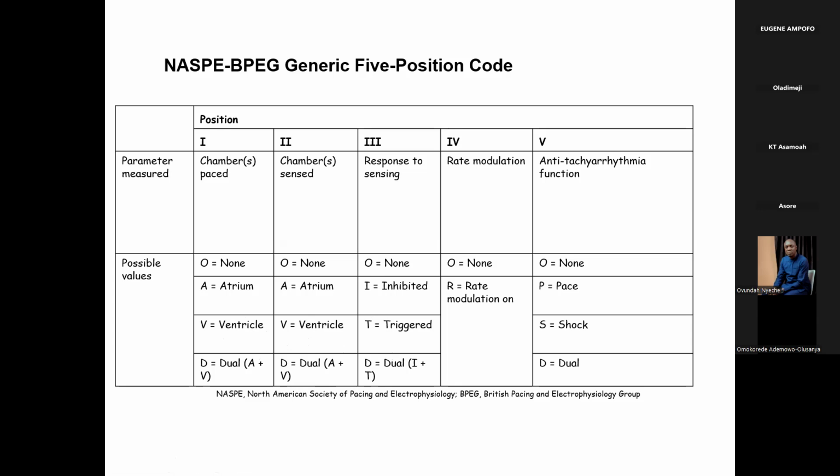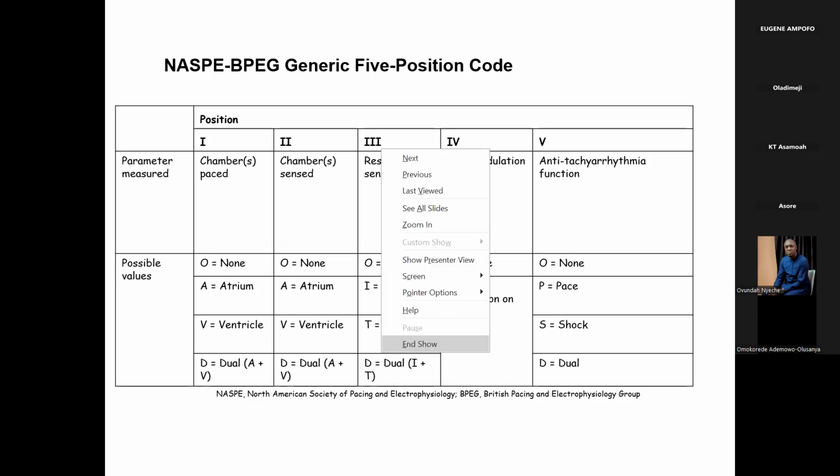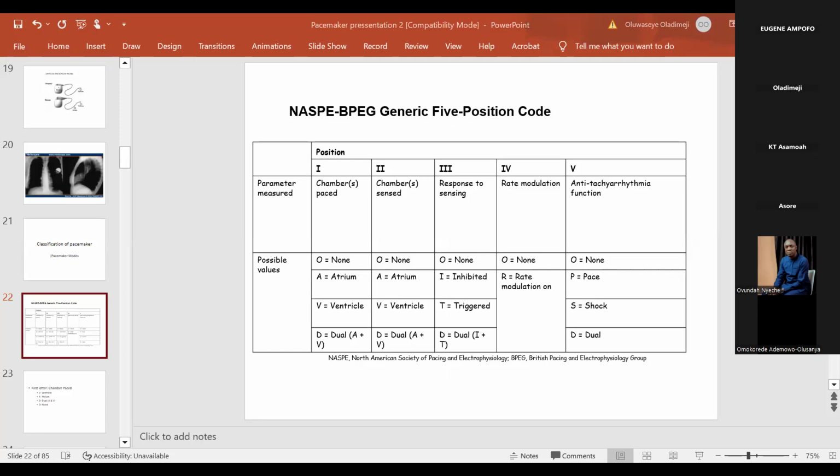Okay? I need us to know that this is a form of programming. Secondly, another form that has been made recently: pacemakers have been modified so much that they are now bullet size. I'm sure we've seen the bullet size pacemaker before. We can all browse the picture. It's not like a bullet where you just deliver them into a particular chamber. I just want to bring up a picture of the bullet size. So they now deliver them straight into a particular chamber. Most of what they make now, they make them into the ventricle. Okay, these are the recent bullet size pacemakers.